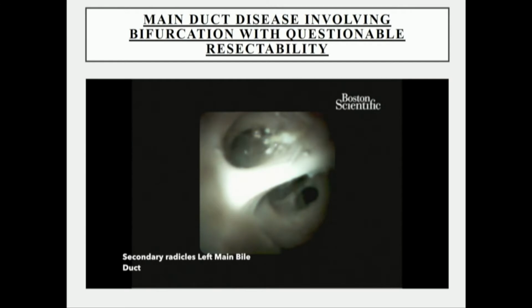In the past, as he said before, this patient would be taken to the operating room, would get frozen section after frozen section until you do or don't know that that's useful. And now I think we can prevent or allow people to go forward with life-sparing surgeries or prevent the cost and morbidity of that surgery. And so this is what you're seeing an example of.